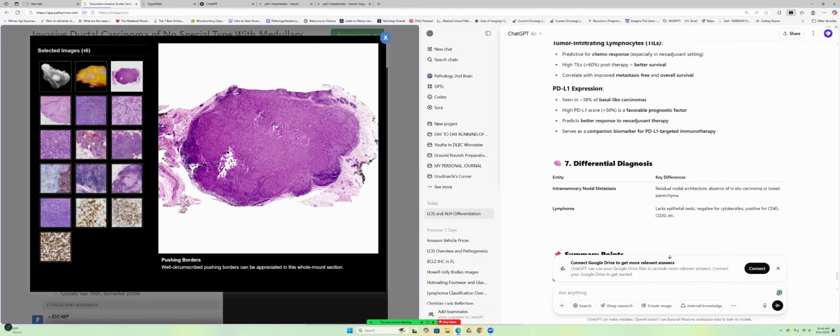So PDL1 expression on the tumor is actually what we're looking for. The other day I asked my attending what test we should order, PD1 or PDL1? She said she didn't even know. We order IHCs for these cases, so it will be PDL1.